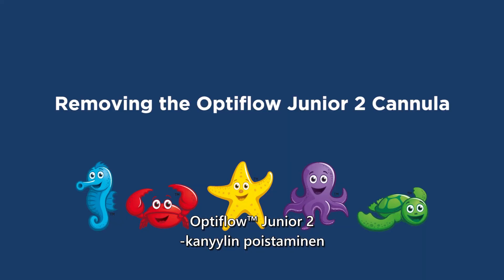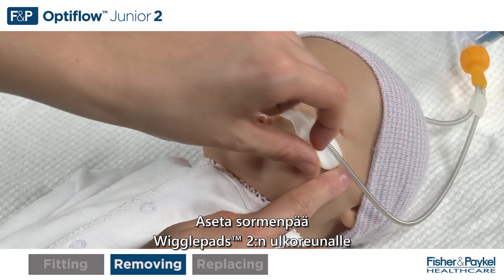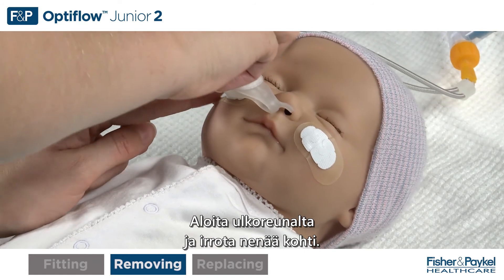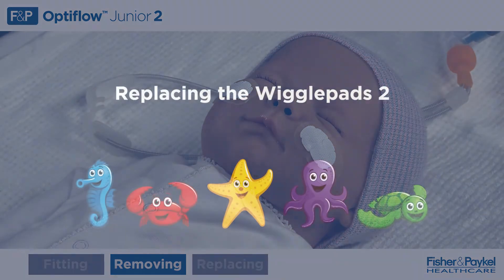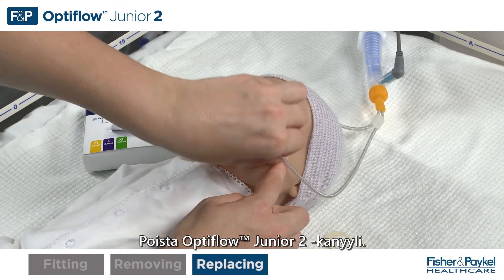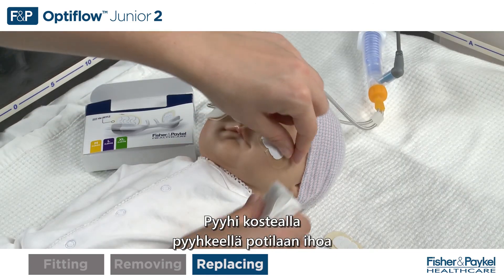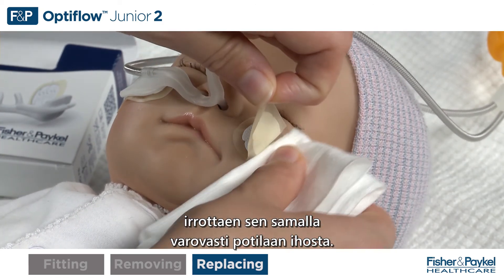Removing the Optiflow Jr. 2 cannula. Place fingertip on the outside edge of the wiggle pads and gently peel the cannula away from the wiggle pads, starting from the outside and peeling towards the nose. Use a damp cloth to wipe the patient's skin and the underside of the wiggle pads while gently peeling away from the patient's face.